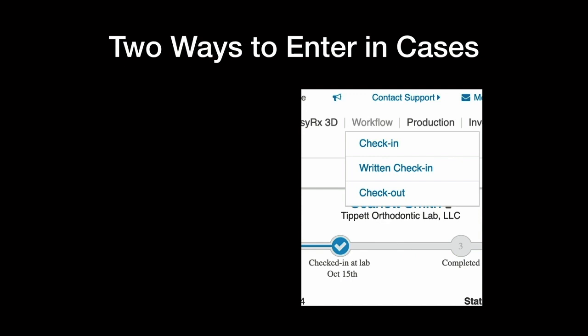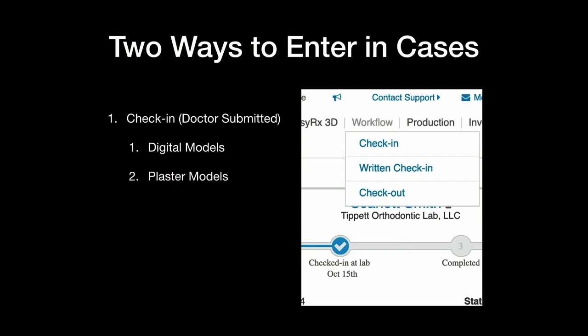So at the menu bar you have workflow, and you have check-in and written check-in. So check-in are the ones the doctors send you digitally, and written check-in are the classic paper script model. So the check-in, the doctors submitted, is for digital models and plaster models. You see how they're starting, they're going parallel. They didn't say we're going to go all digital and screw the rest of you that do analog. It's like, hey, we got a method for both ways. You can provide for your doctors either way. I have doctors that don't use the EZRX at all. They have no idea I use it, and I enter them into EZRX just like a regular software.